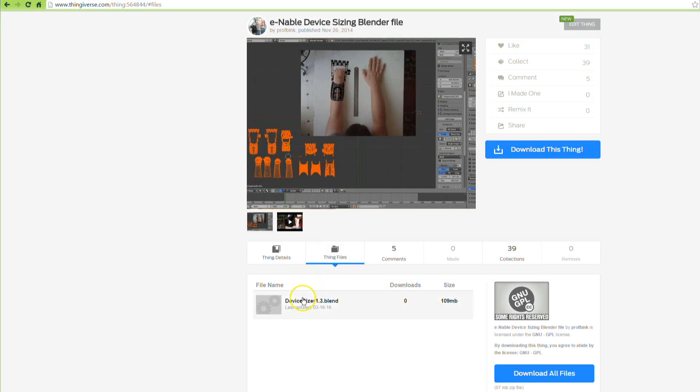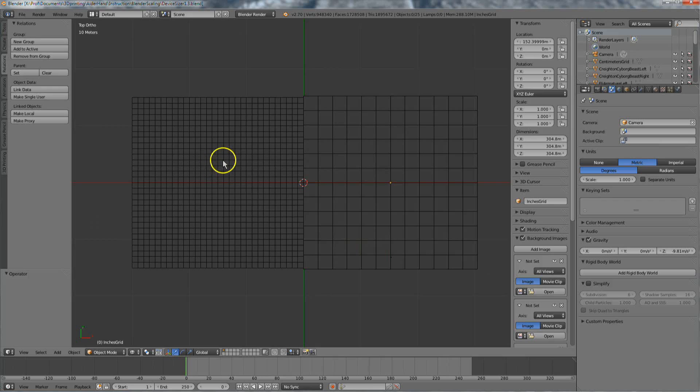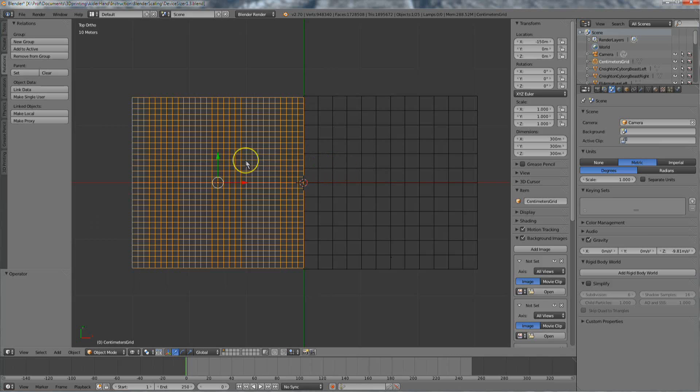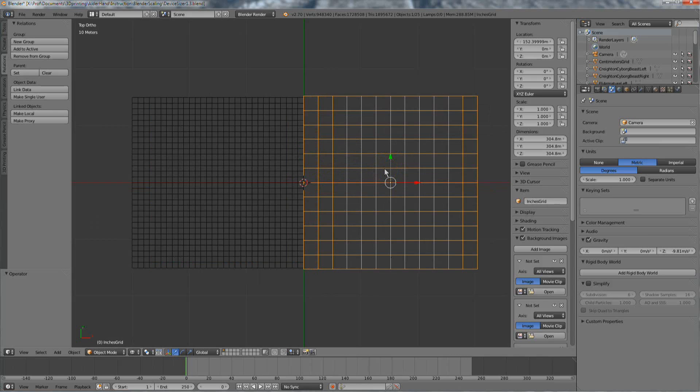Open the Enable Device Sizing Blender file, which you can download on Thingiverse. Device Sizer, version 1.3 and beyond, contains models for centimeter and inch grids, which help with the image scaling process.